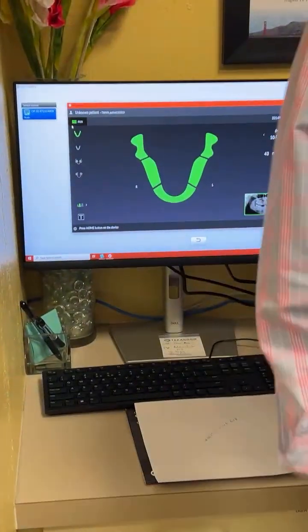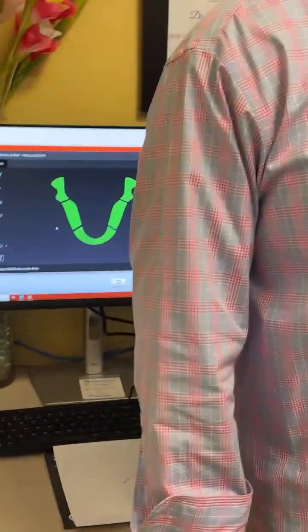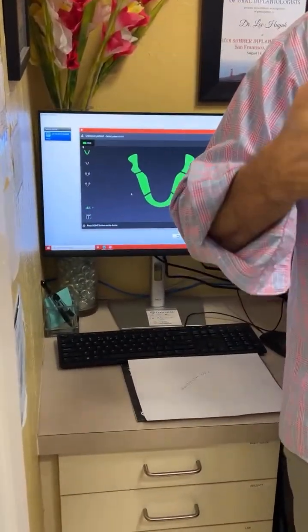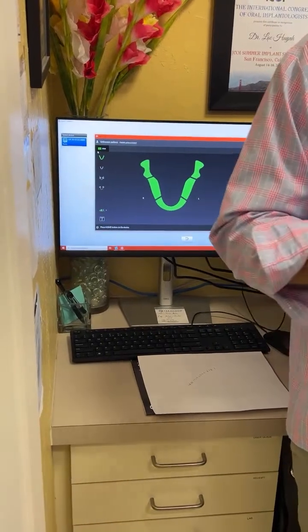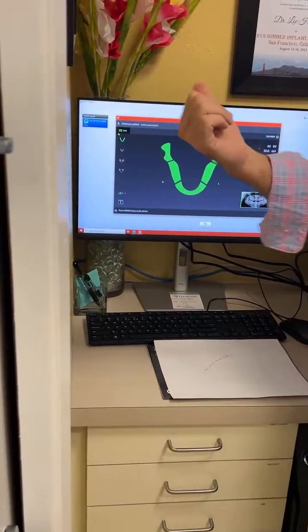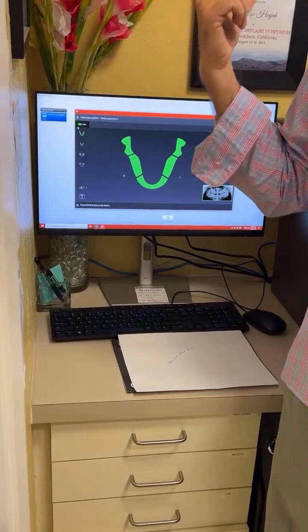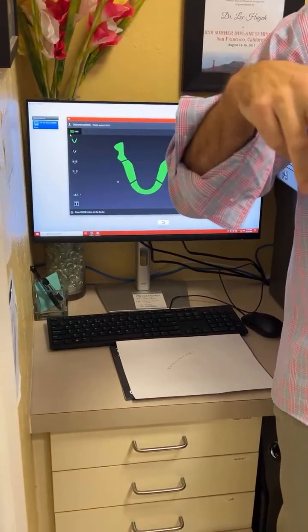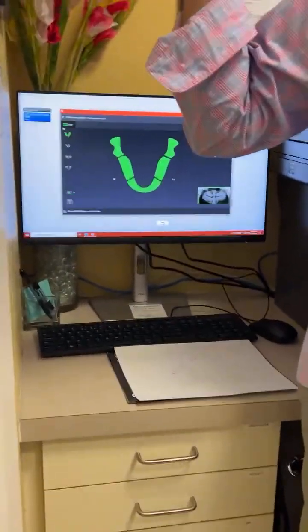Could you train us for both 2D and also 3D? Yeah, the 3D, we don't go through EagleSoft because, like I said, they can't take it into EagleSoft. It doesn't know what to do with the data. That's where you go into DTX, the software that I showed you a second ago, and you find the patient name in the database there, and then you would hit acquire from there.